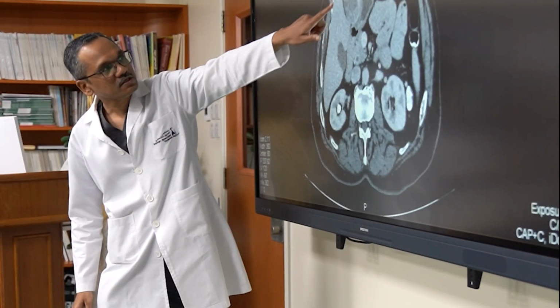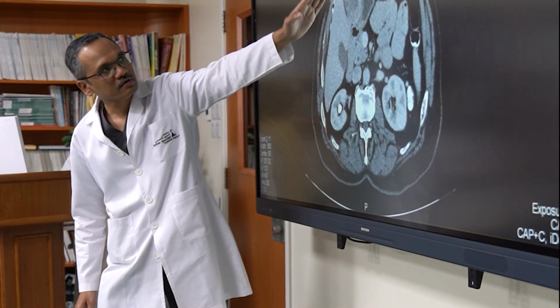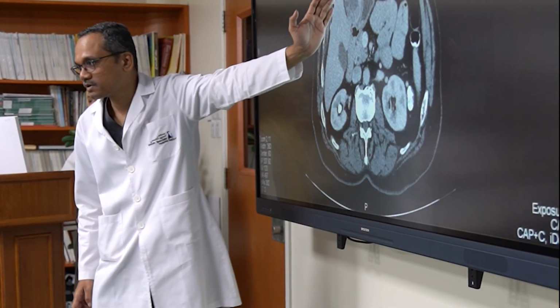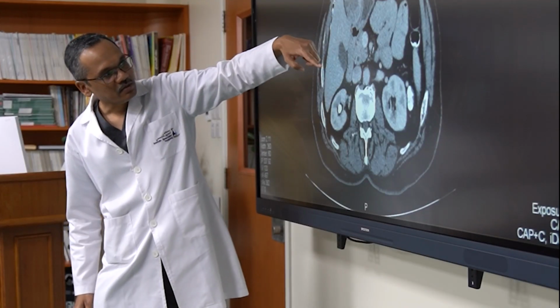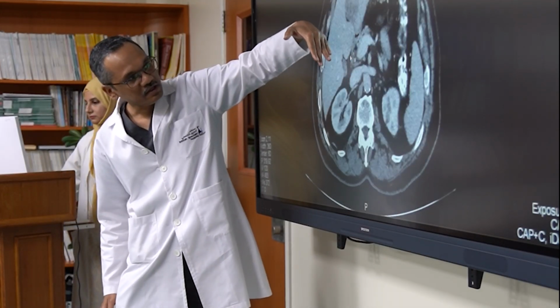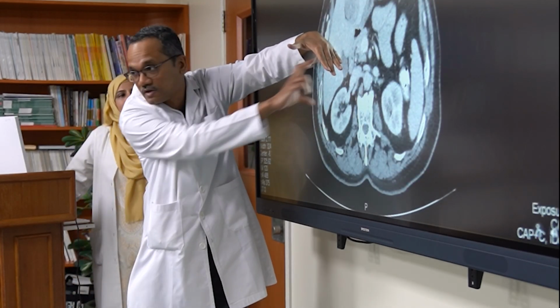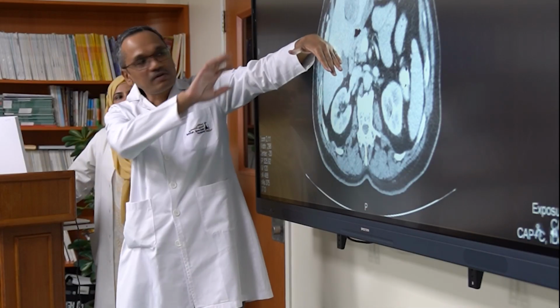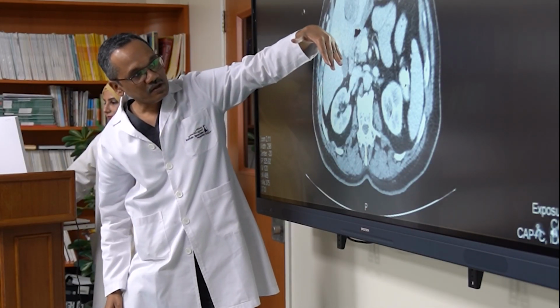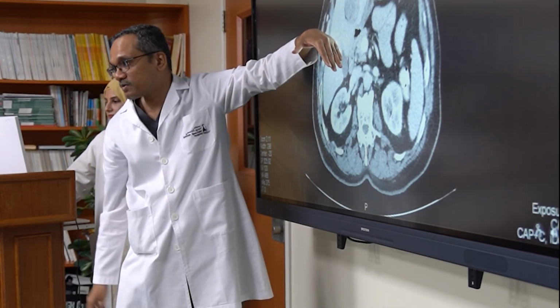So this lesion is in segment 3. And whenever we want to resect, we can't resect here because we need to give adequate margin. This is the gallbladder. So his middle hepatic vein will be at the bed of the gallbladder. So when we do a classic left hepatectomy, hemihepatectomy, we leave only this much of the liver. So this liver will not be sufficient to take over.